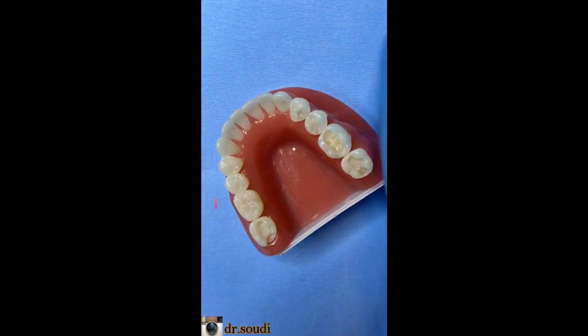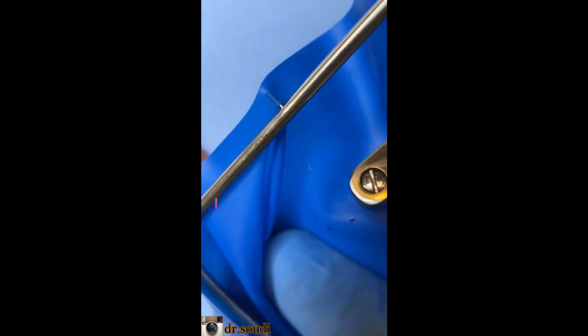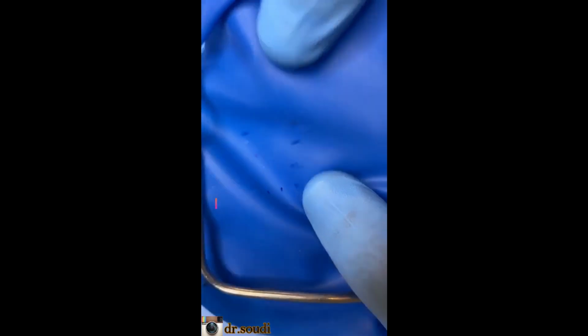And we will punch. We talked about how we will punch, right? Like this. We will free the sheet to make a uniform one. Don't rush. Okay, take your time because any mistake you will pay for it.